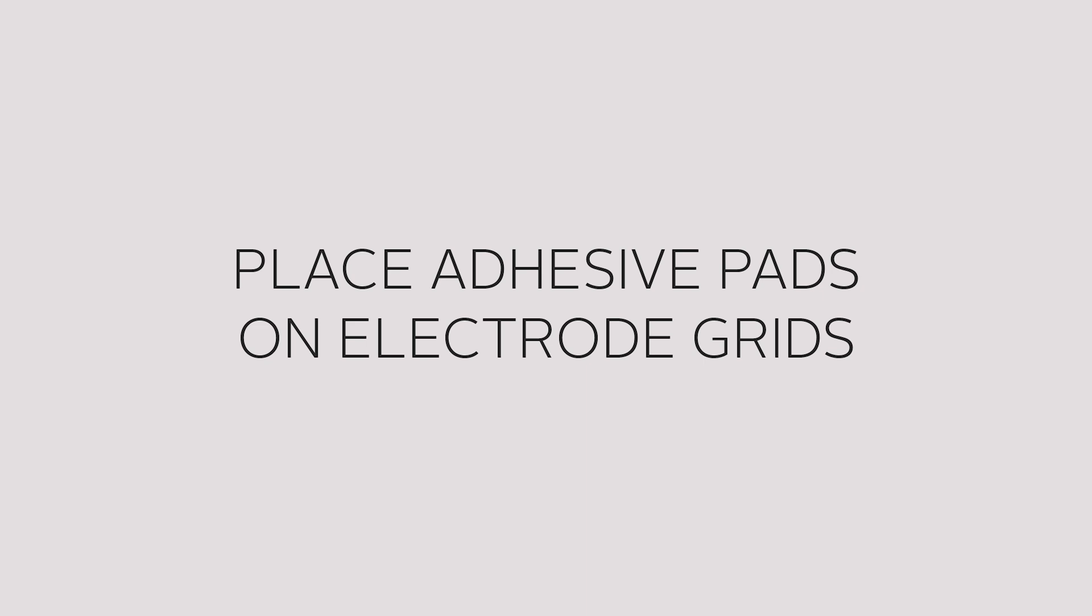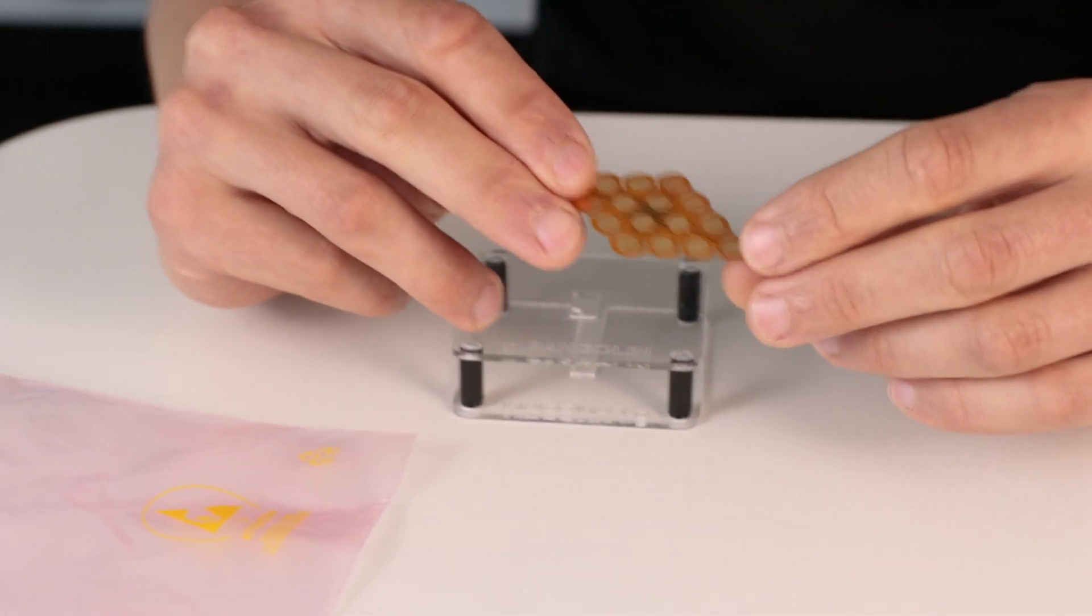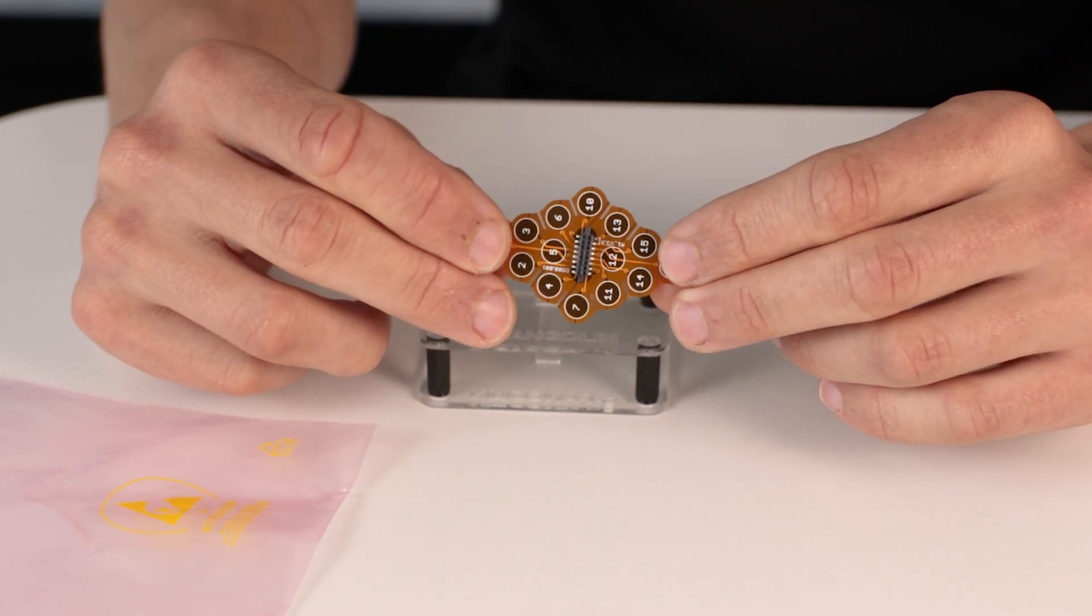So the first thing you do is take out the grid, the new 16 channel Pangolin EEG grid. So here you can see the gold plated electrode dots and here the connector from the grids.